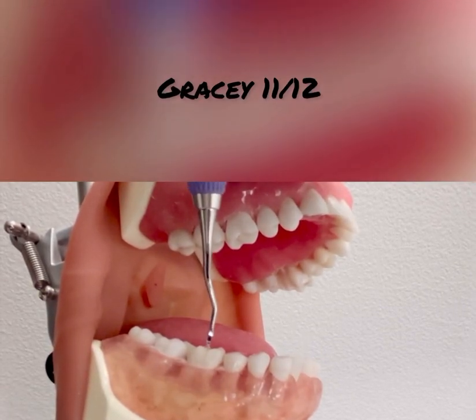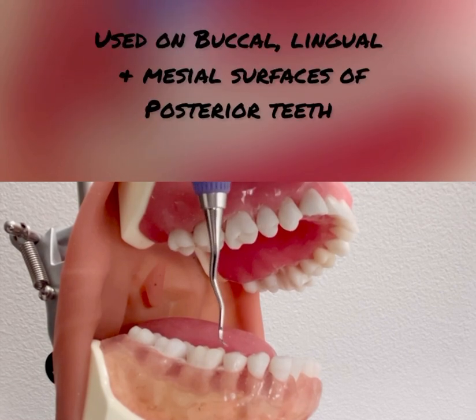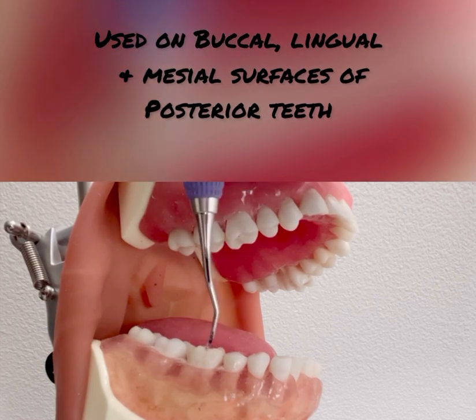Introducing the Gracey 1112. This instrument is an area-specific curette that can be used on the buccal, lingual, and mesial surfaces of posterior teeth.